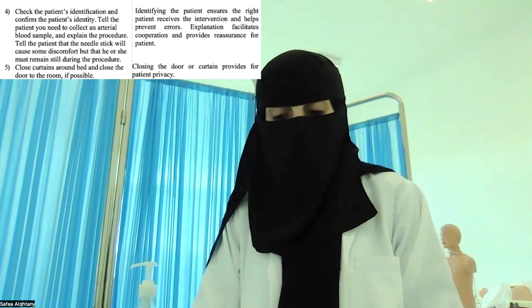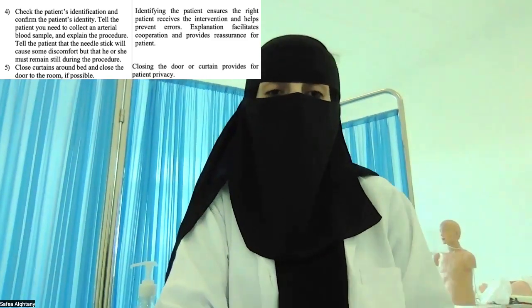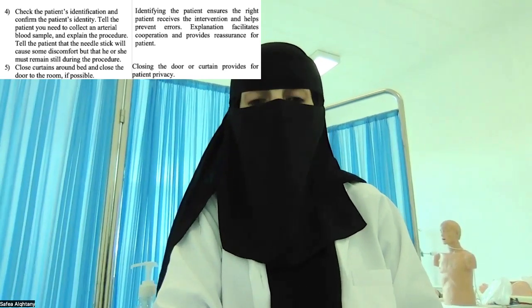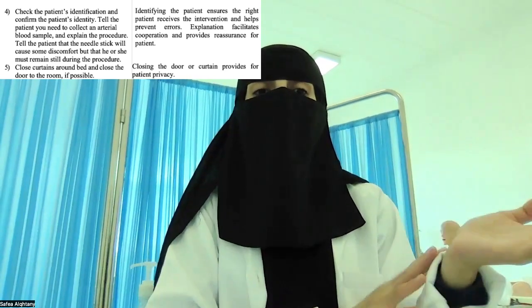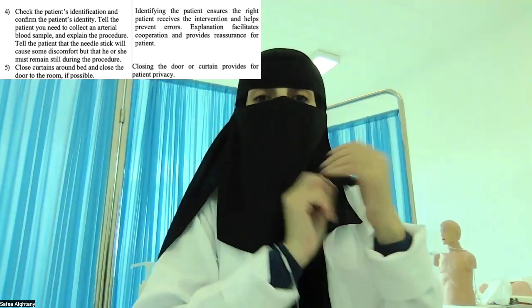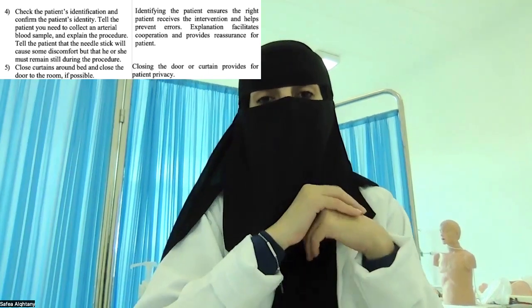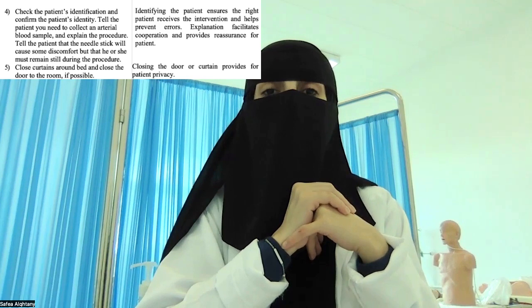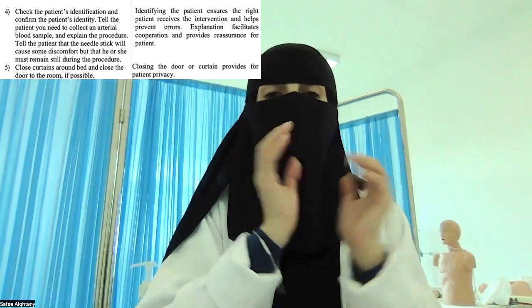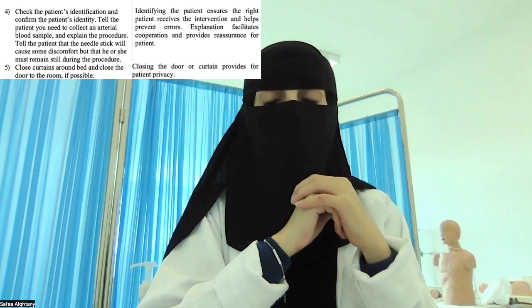Then I need to explain the procedure to the patient. Explain to the patient that this procedure might be slightly painful, and he needs to keep his hand stable at all times and not withdraw his hand when the healthcare provider starts to penetrate the site, because this might cause heavy bleeding. يعني ممكن يصير في نزيف لو لا سمح الله سحب يده أثناء ما بدأت أدخل الإبرة، فلازم أعطي explanation from the start.